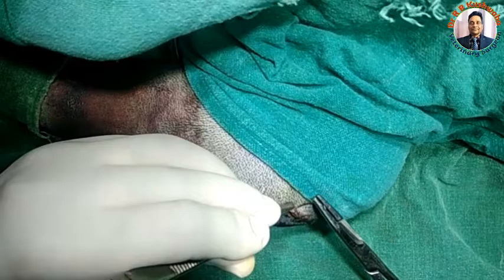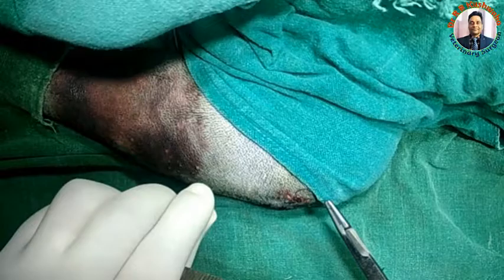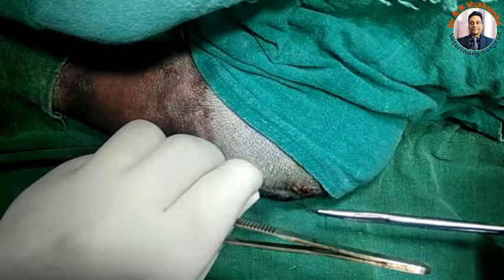Now I will cut from here close to the skin. I have cut the extra portion of the pin. The next step is a closure suture — this is a very small incision, just one simple interrupted suture. Although I performed manipulation during the closed reduction, that manipulation is even better than open reduction.